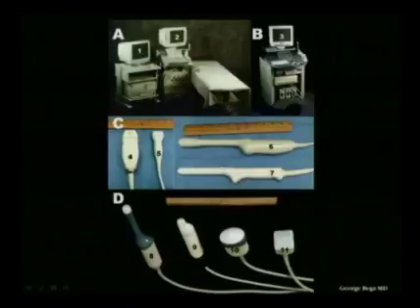So here is a normal 2D conventional ultrasound machine. Here is a computer workstation. They are connected to each other from the video out port of the ultrasound machine to a PCI video frame grabber on the workstation. And as the operator acquires 2D slices with the 2D machine, a volume is acquired in the workstation. This small box here is a position sensing device that helps register the 2D slices.